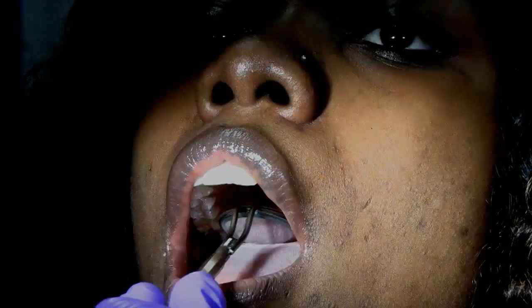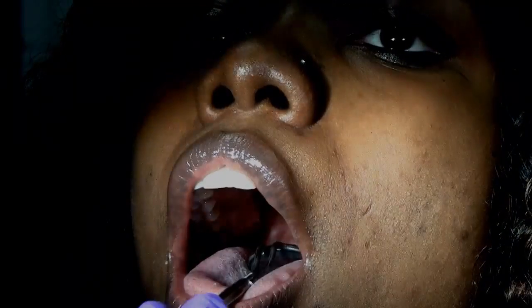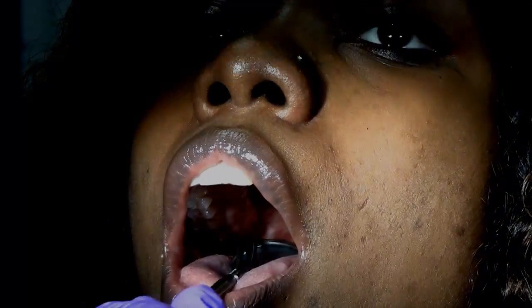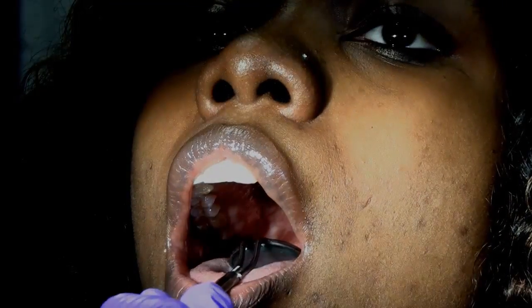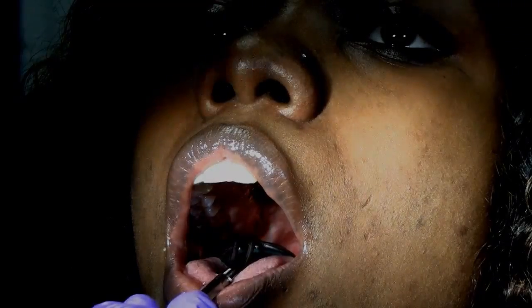Using a mouth mirror, we'll ask the patient to say 'ah' and check out the uvula and the tonsillar pillars, looking for any obvious lesions, redness, or irritation there.